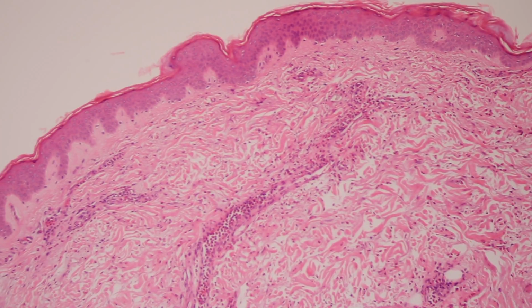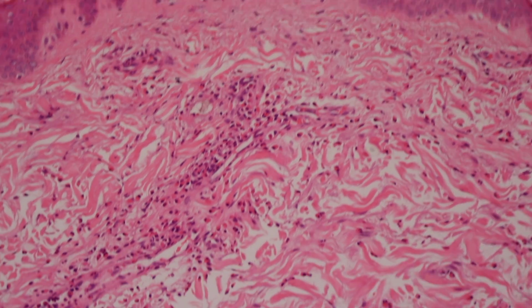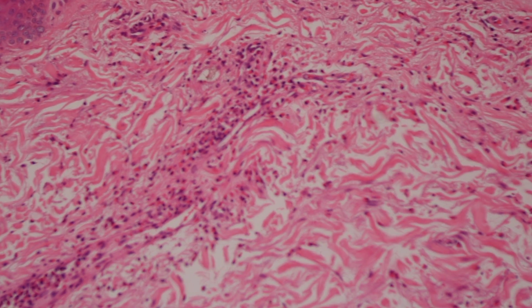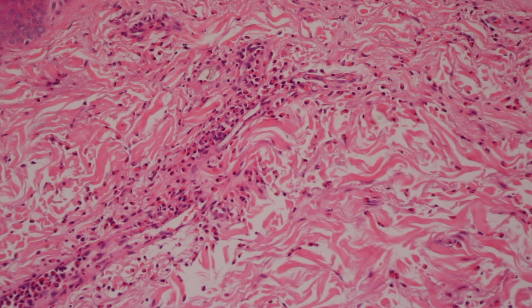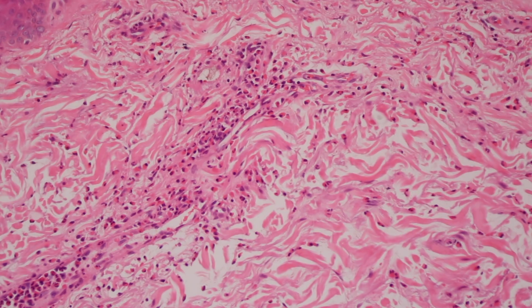So here the vasculitis, there's a lot of inflammation, but the damage of the vessels is relatively subtle. Another thing that sometimes helps me if I'm struggling to tell if there is vascular damage is if there's clinical evidence of purpura or erythema, like lesions that look red and purpuric like vasculitis. If I think I see some hemorrhage that might be vasculitis microscopically, but clinically they don't think it looks at all like vasculitis, it doesn't mean that it couldn't be vasculitis, but it really makes me hesitant to be definitive about a diagnosis of vasculitis, because usually clinically they're pretty astute on suspecting vasculitis.